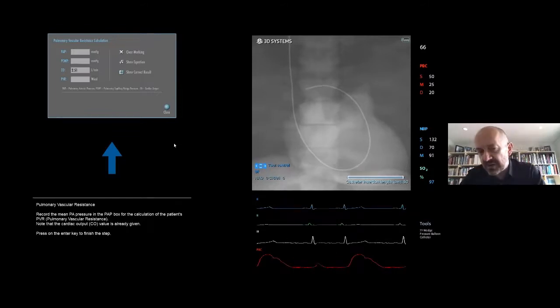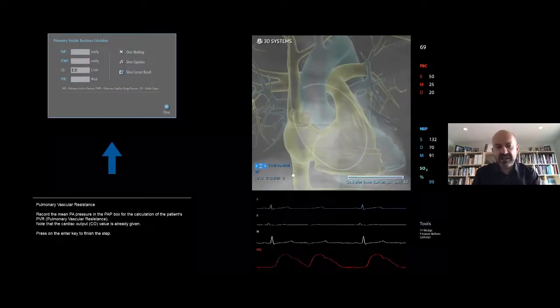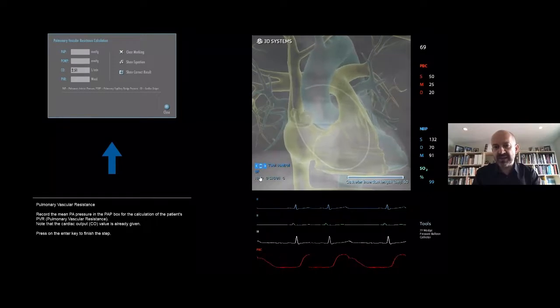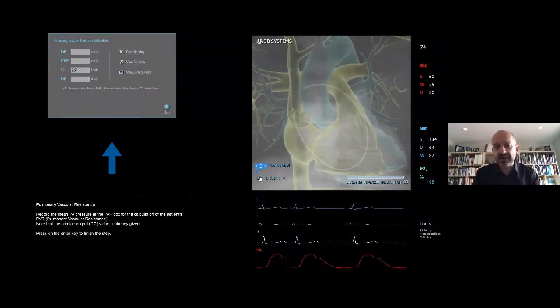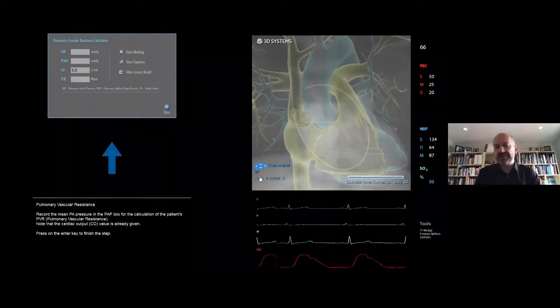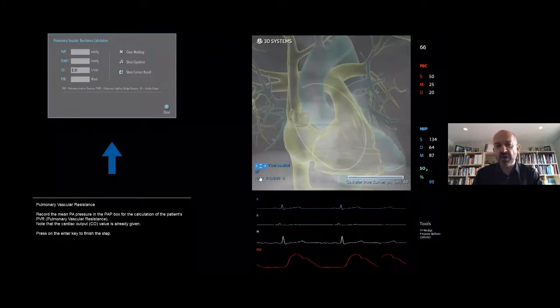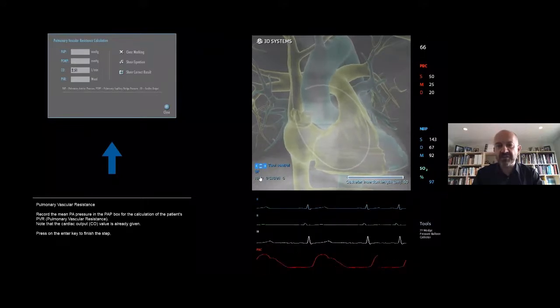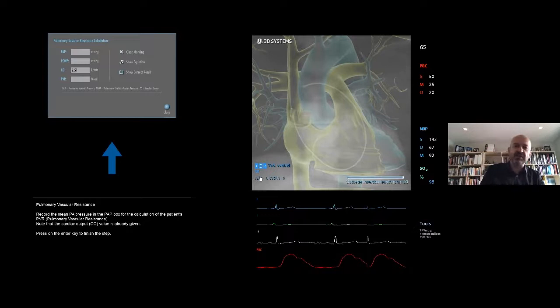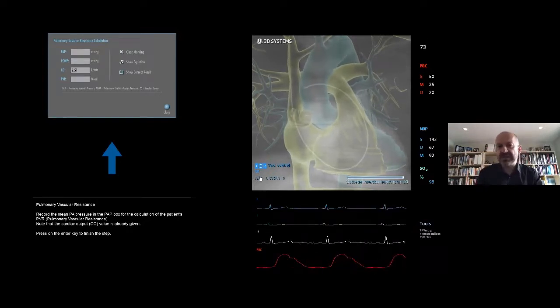We talked about some of the positioning, and I think this is very good on the simulator. Nitzan, if you can go to the overlay, I think this is the nice thing about this 3D Systems Mentor, because it does help you understand things that didn't exist before. And again, I wish we had this when I was in training as an intern, because you had to have a wild imagination to know where you're at, but now you can actually see this, which is really great.